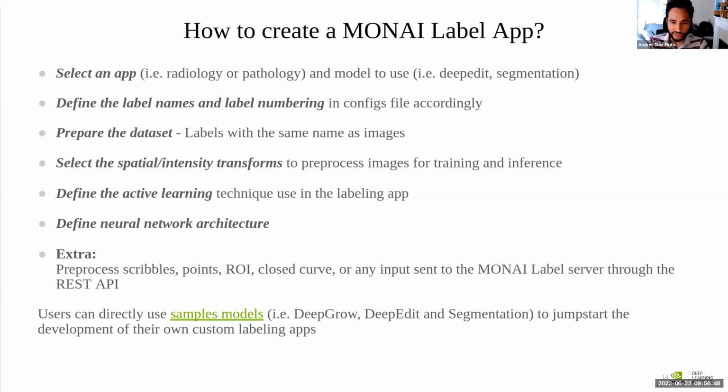On top of the applications that we offer as examples. There is also a tutorial in the GitHub repository on how to modify the transformations and everything. If you have any question, please don't hesitate to ask or open a discussion in the GitHub repository.